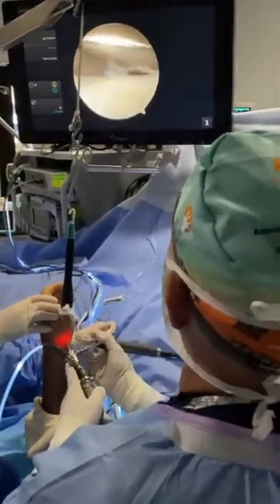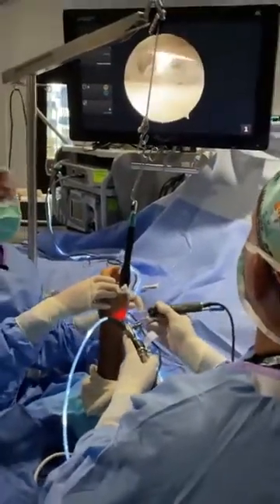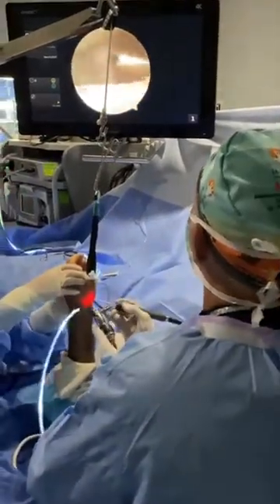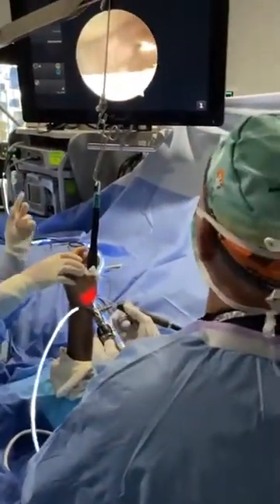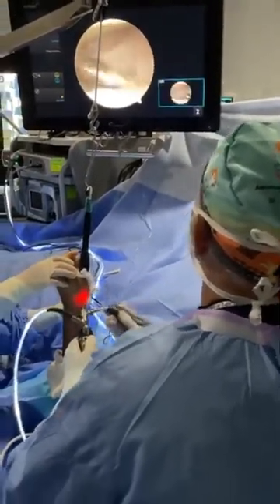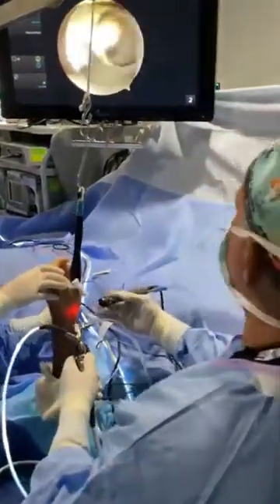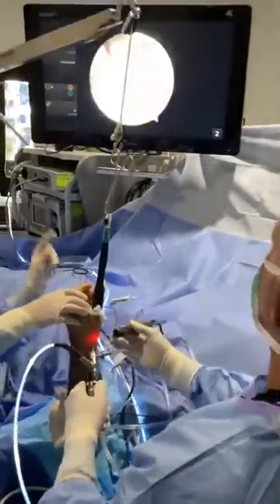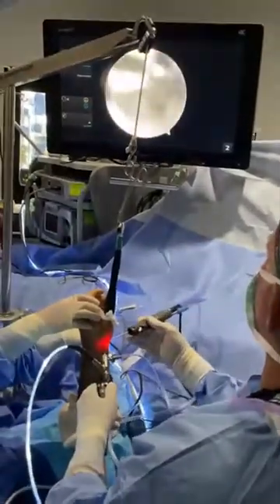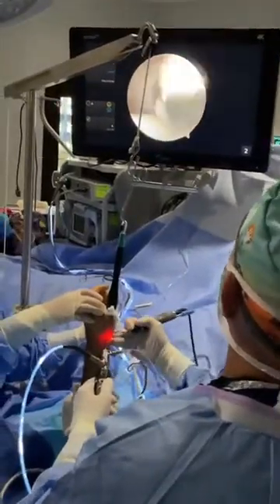This is a two-millimeter shaver. I'm going to take a picture because I want to show the patient. In my experience, the most important part is once I do this synovectomy — removal of the inflamed synovium — then I tighten it, and we'll have him in a cast for a few weeks just to let these ligaments tighten a little bit. Then we'll do a little bit of hand therapy and that should be it.